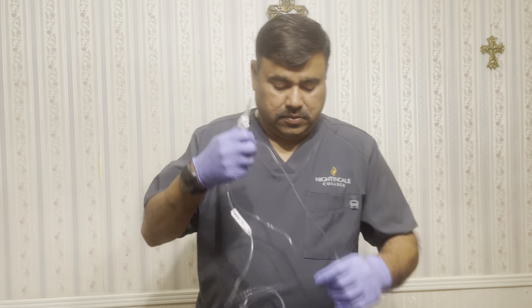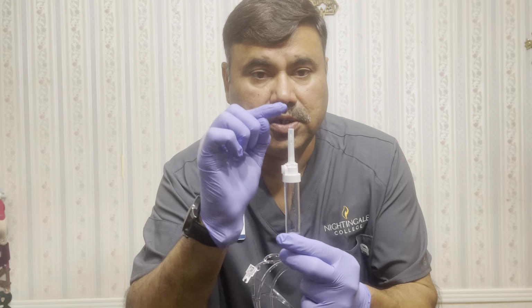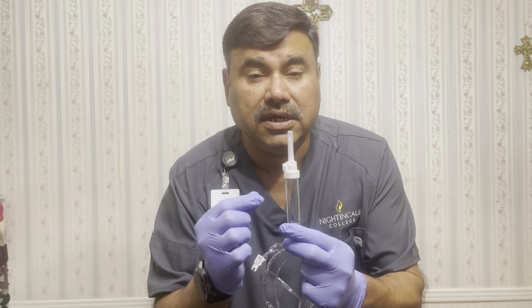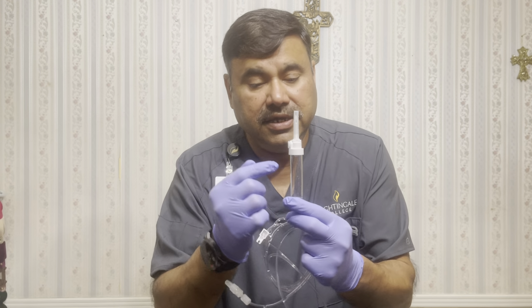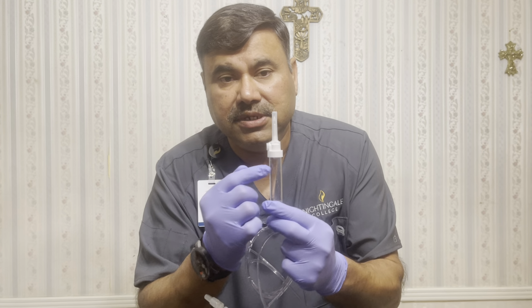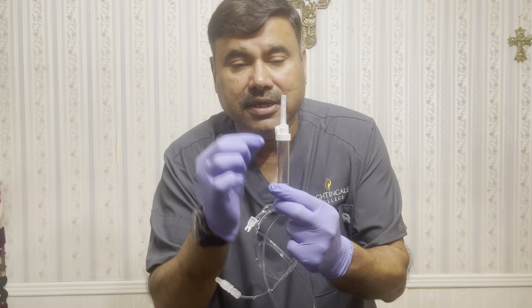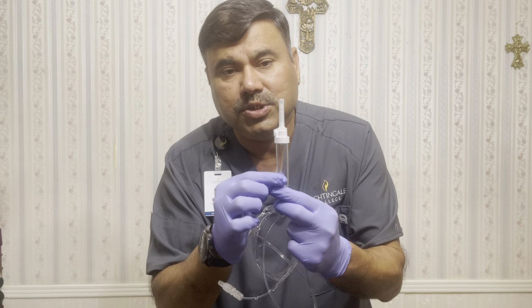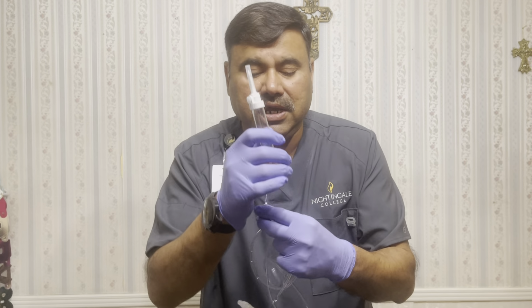First, starting with my spike, which is on the top area and is covered. I will keep it sterile and covered until I put it into the fluid bag. Here is my chamber. I'll be filling it halfway, and here I'll be watching the drops coming in. The air bubbles will come up here, which will show if there is any air coming in, so it does not go into the patient's IV.